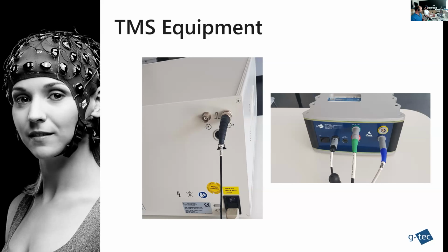But for those of you who followed this morning, we tried also other systems for the triggering, and we used, as Christoph showed this morning, an Arduino controller to generate the trigger pulse, which is at the moment the fastest option that we detected.